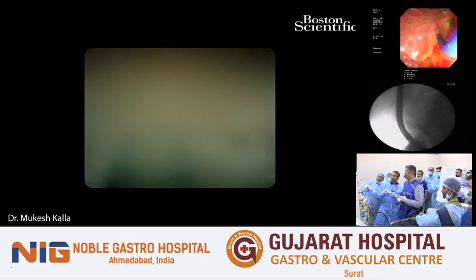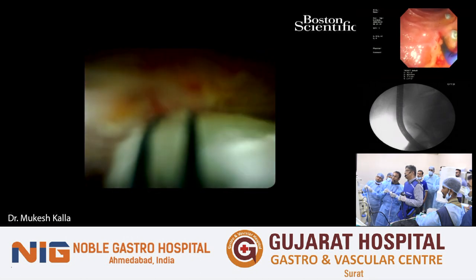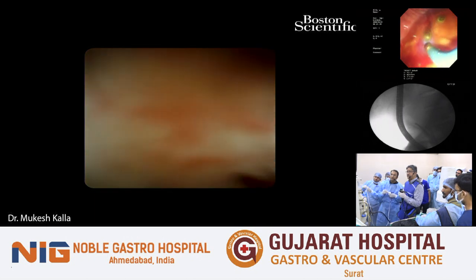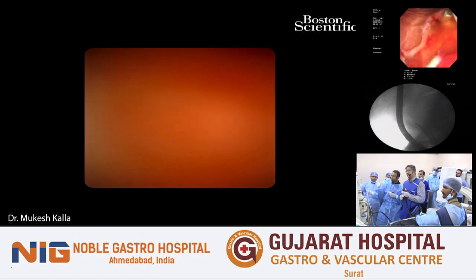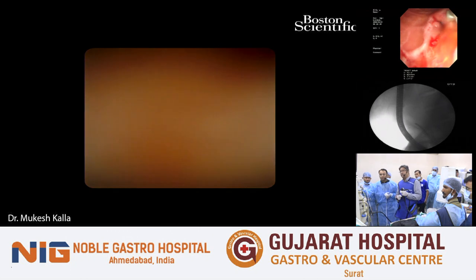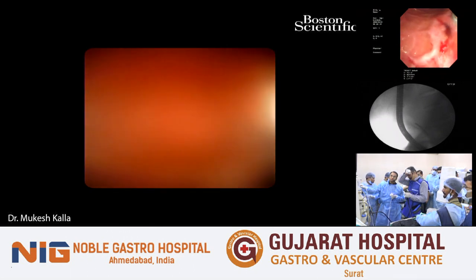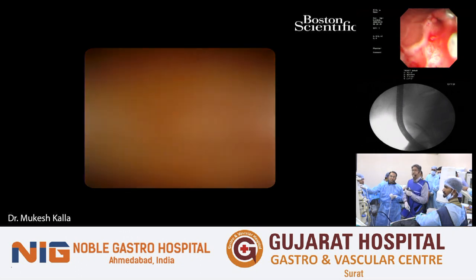Most routine ERCP doctors, the question is, a standard basket would be doing similar tricks and maneuvers for retrieval of stones. Do you feel like spy basket has a certain advantage in any particular situations over a standard basket through fluoroscopy guided access? Yes. I mean, Saurabh, like those intrahepatic stones, those stones at the end of it, because you need to bring them out under the vision, then you need a spy basket.